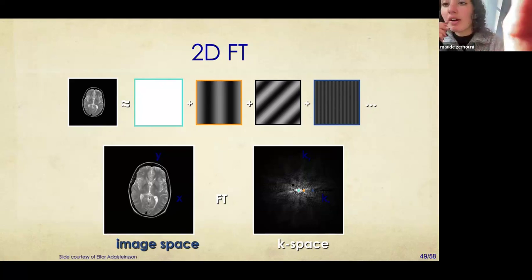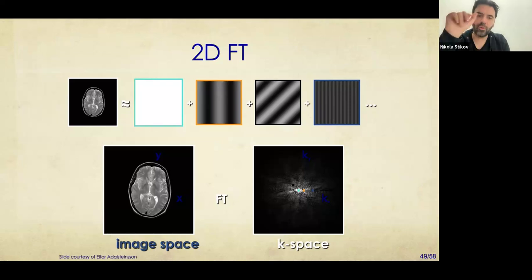I'm just wondering, I'm pretty sure it's just a principle, but do we only use a fixed direction of polarization, or do we rotate something? Does it vary with time? Yeah. So basically, we control how we acquire these points, and I will show you how we do that. In general, there's an order to it. So, we go either in a spiral or we go rectangular, but we completely control which points are acquired at which point in time. Was that your question? Yeah. I wonder how we do that. Yeah, so we're getting there.